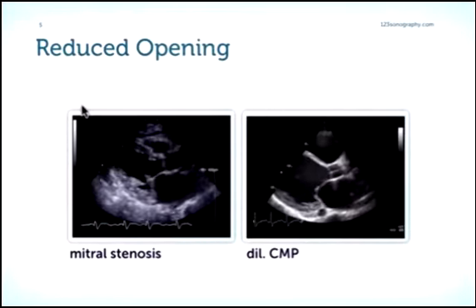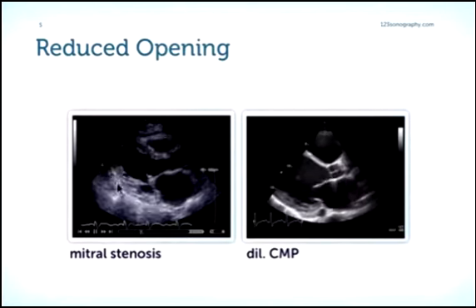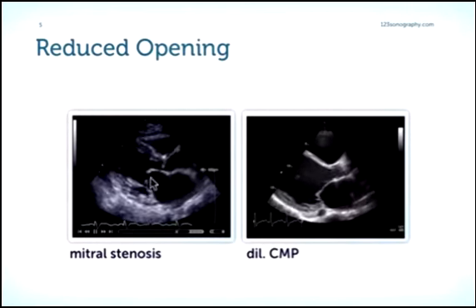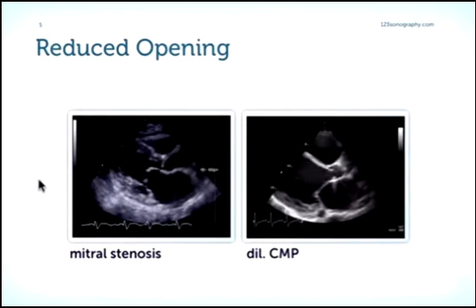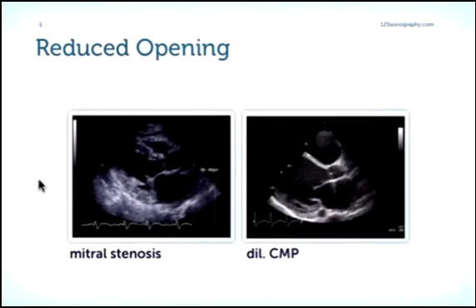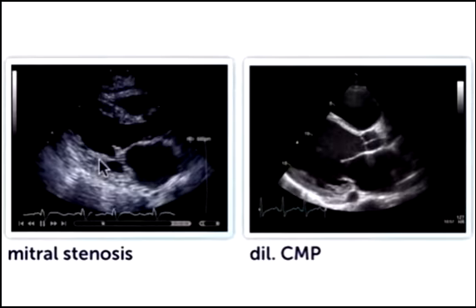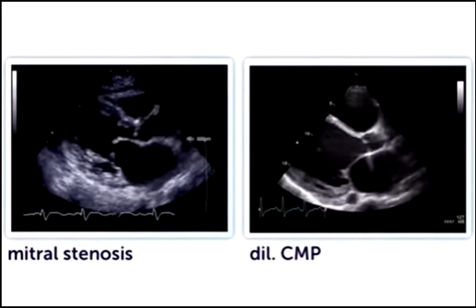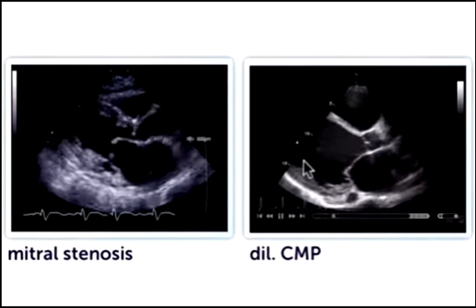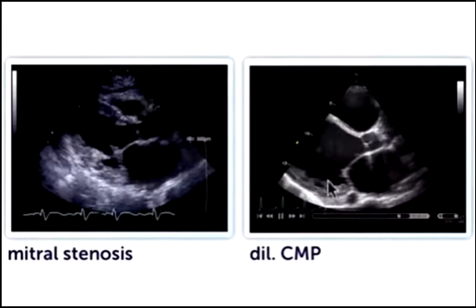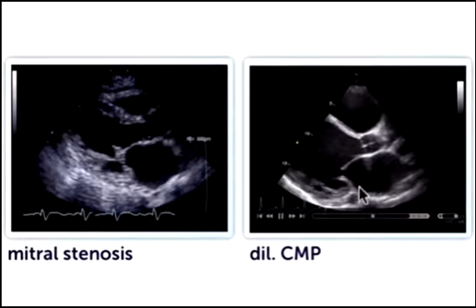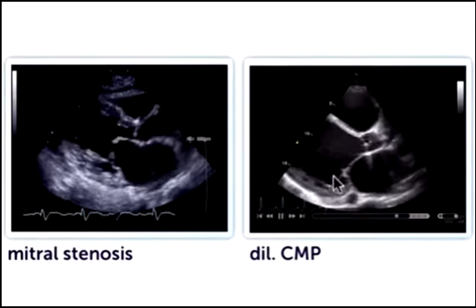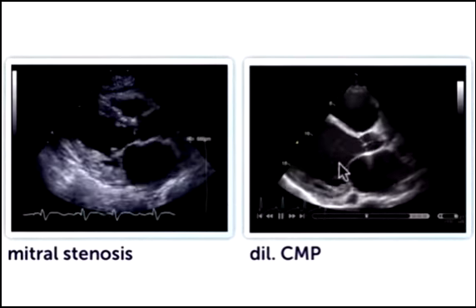Here's another example of a patient with doming of the anterior leaflet — maybe not as much doming as we saw previously. We have a reduction in the opening. And here we have an example of a patient who also has a reduced opening of the mitral valve, however no doming.